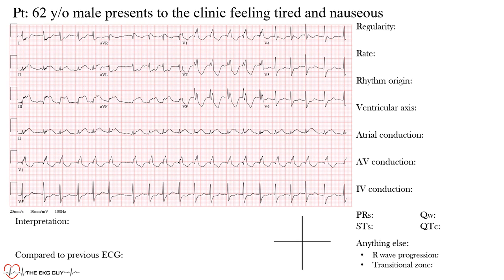Hopefully you had a chance to go through this yourself. Here we have a 62-year-old male presenting feeling tired and nauseous with this EKG. The first thing we want to do is look at the regularity of this rhythm — is this a regular or irregular rhythm? One of the best ways is by looking for a lead that has tall R waves or big complexes.